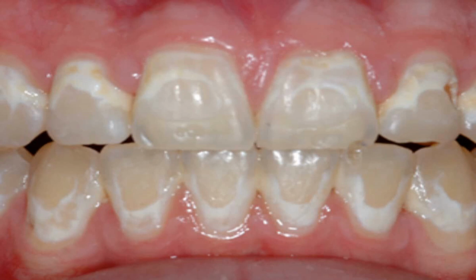Infiltration has also been shown to infiltrate hypomineralized enamel of non-carious developmental origin. A laboratory study reported infiltration to an average depth of 0.67 plus or minus 0.39 millimeter in hypomineralized enamel lesions. Polymerization-inhibiting substances, such as products containing eugenol or temporary cement, must not be used in combination with this material.